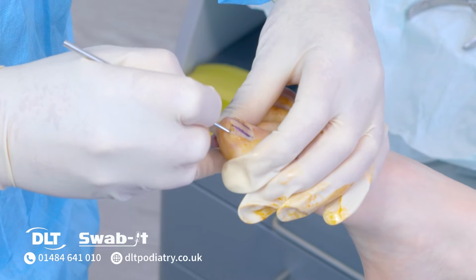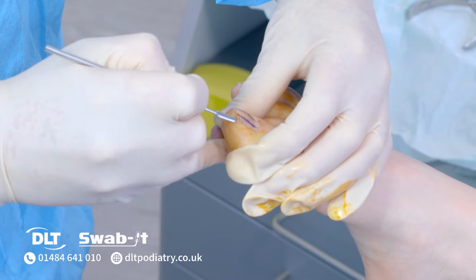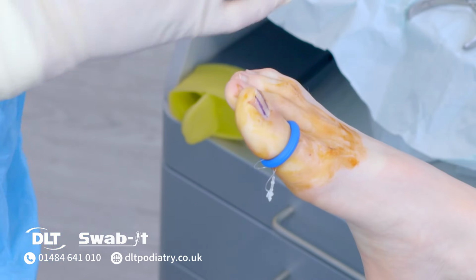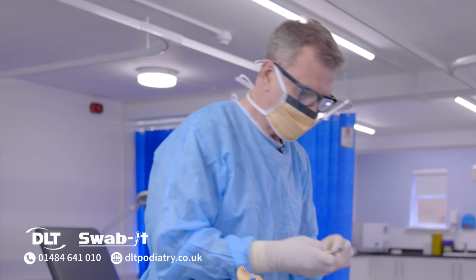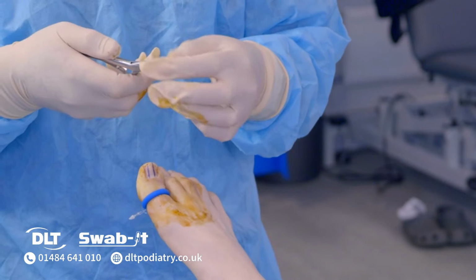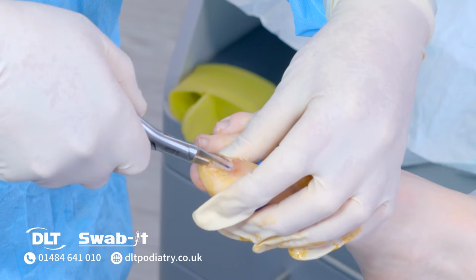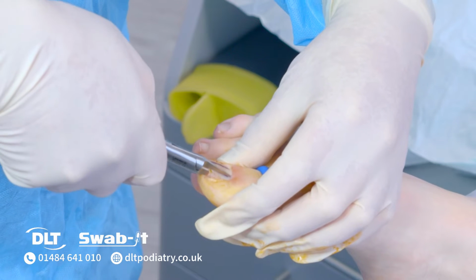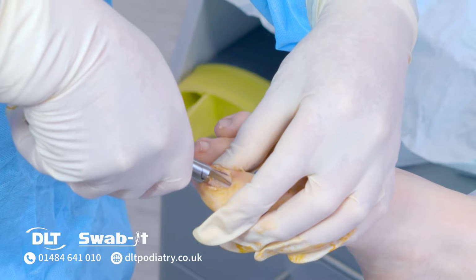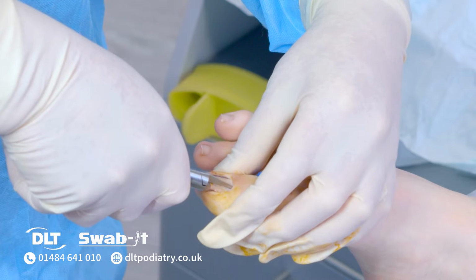It's always worth noting that gentle tissue handling is really beneficial with post-operative healing and also post-operative pain. It can reduce the post-operative pain that the patient may experience. Then we take some Thwaite snippers, flat edge down, cutting edge on the top. Position the toe so it's comfortable. Then, if you elevate your arm, you can actually get under the eponychium, which is really helpful when you come to use your chisel blade.